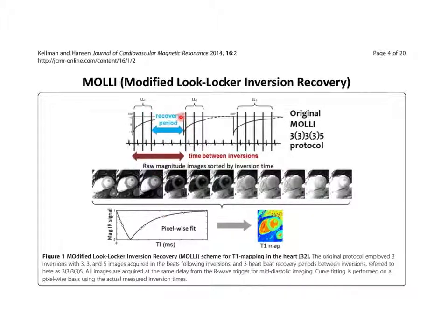And we do that three times, essentially. We now allow the whole thing to recover, go back to M0, do another 180-degree pulse, and read out another short delay image, and that will be the second point on this curve. This one will be a slightly longer delay than the first, so that'll be this second point here. And again, this one will be this point up here. So now we have 1, 2, 3, 4, 5, 6 points along that curve. We then do it again, but with 5 pulses, and we fill in this point, that point, that point, and then 2 extra ones here for the baseline. So now we have that set of points there.